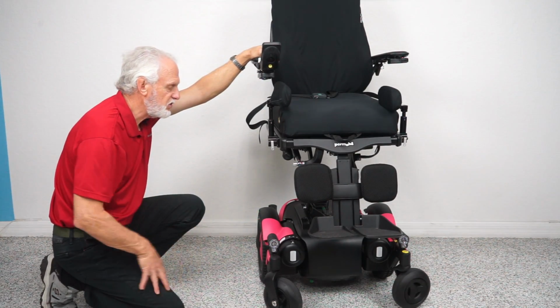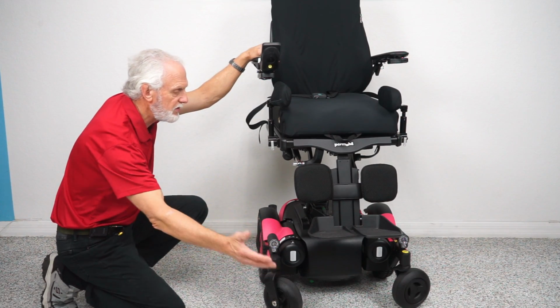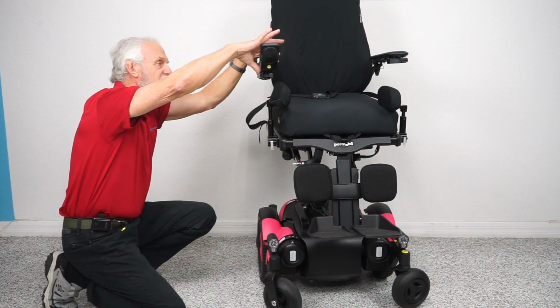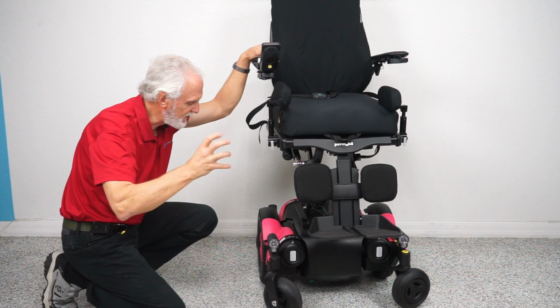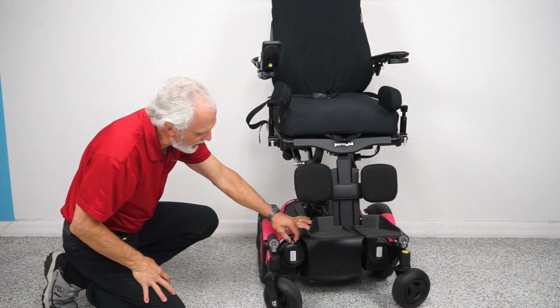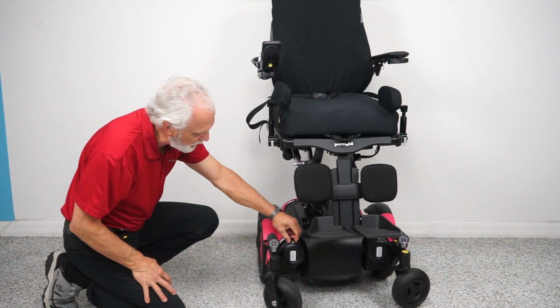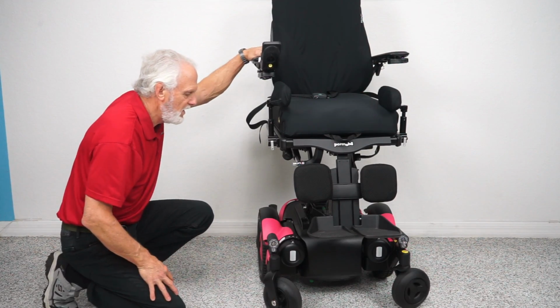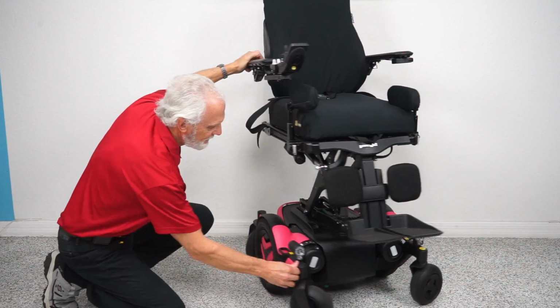Now, I said earlier, this chair weighs 425 pounds. What if you have an issue with the chair 5, 6, 10 years from now? How would you roll it? Well, if you want to roll this chair manually, all you have to do is turn the power off. Make sure the power is off because these are electric motors. You want no resistance. On top of your motor, you can see my fingers right there, there's a little handle. It's about 1 inch by 1 inch, not really big. Push them in like this, inward, and now you're in neutral.